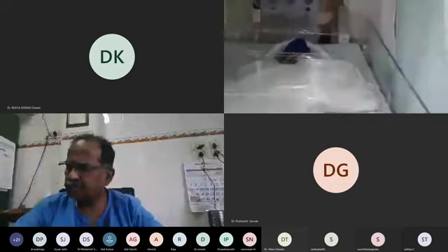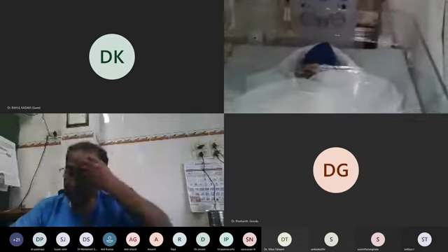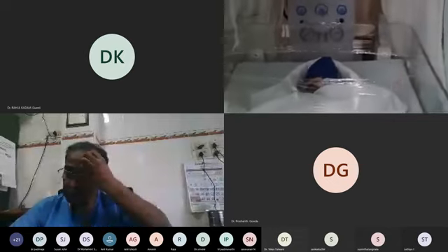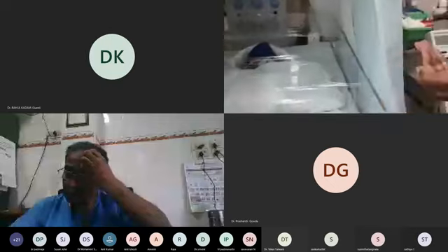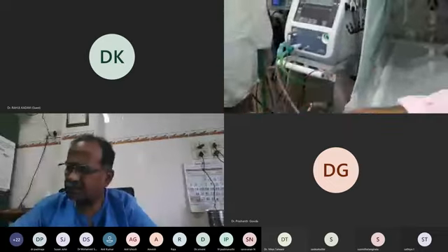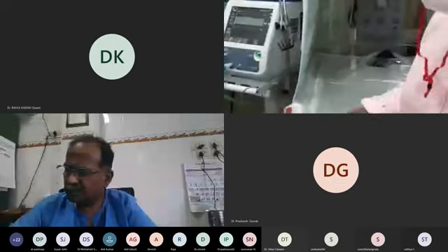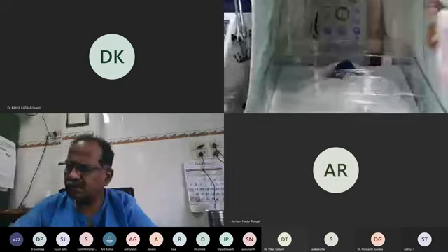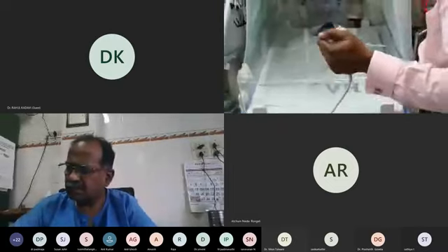First of all, do the hand washing. We have done the hand washing. However, I touched my mobile, so that is the reason I'm still doing the sterilium hand washing. Once I do the sterilium, always in a neonate, try to use the linear probe. The linear probe. So we have washed it.